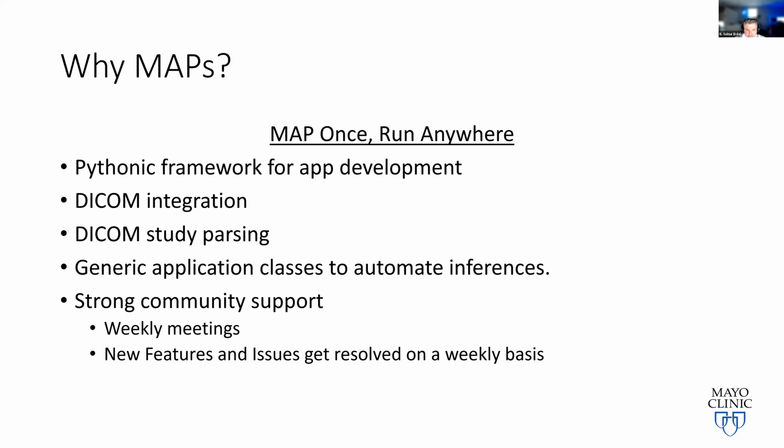And you should be able to support things such as DICOM integration and DICOM study parsing. You should be able to use general application classes to automate your inferences. And the idea is also to have strong community support behind this, which we do. We have weekly meetings. We discuss new features. What else should we add? What else could we add? Just like our friends in OHIF are doing their weekly meetings, we have a similar situation on our end too. And it's open source, Apache 2.0, knock yourself out. That's the idea.